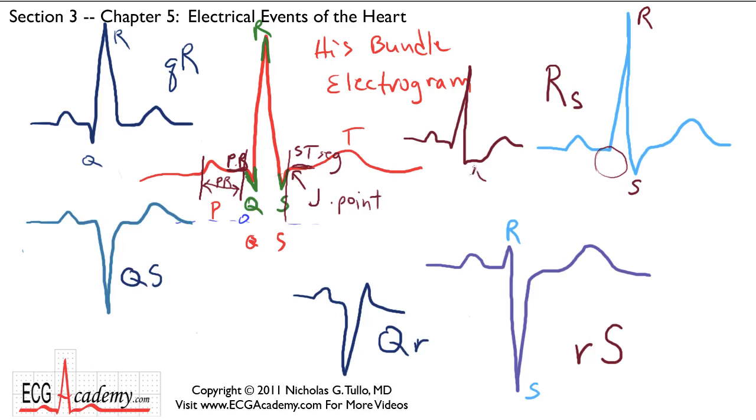So this is where the ST segment becomes important in diagnosing underlying heart muscle conditions. Finally, the last interval that I didn't mention is the QT interval, which is from the beginning of the Q wave to the end of the T wave. I'm just mentioning this, but when we get into the chapter on actually measuring these intervals, we'll be able to make certain diagnoses based on the measurements that we'll do with a real ECG.